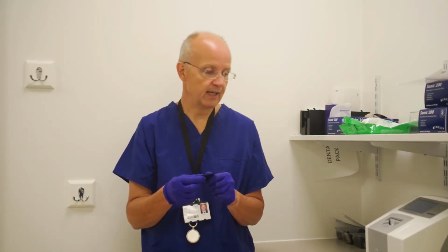If you see that big copper dot, you have placed it in the wrong way around. Okay, so now we're going to go and look at how we actually use those phosphor plates on Dexter. Carly.